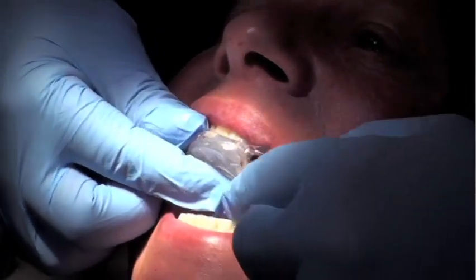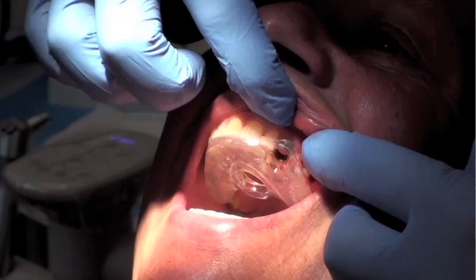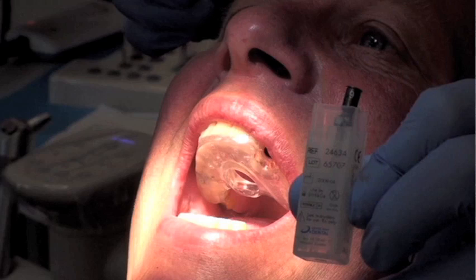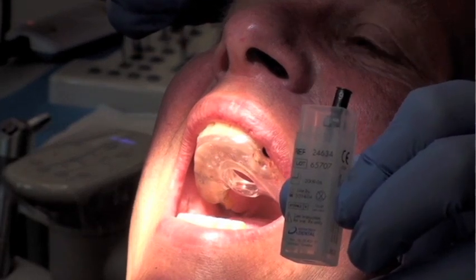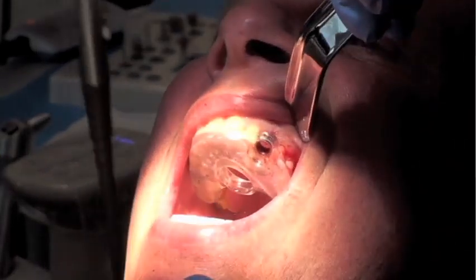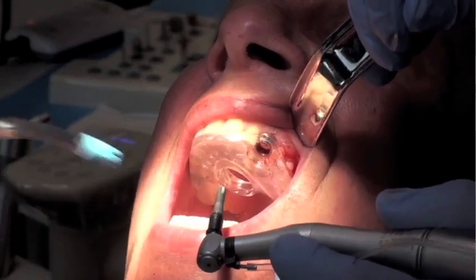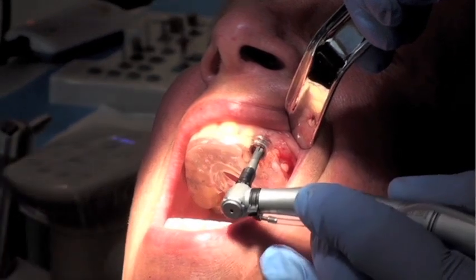We're re-seeding the guide so that we can place the implant through it. The master sleeve in the guide allows us to have truly guided implant placement. What you see here is a 9mm implant holder on top of the 4.5 Astra Osseospeed implant. You can see that complex attached to my handpiece — we're going to be inserting this implant at a torque of 25 newton centimeters with copious irrigation.